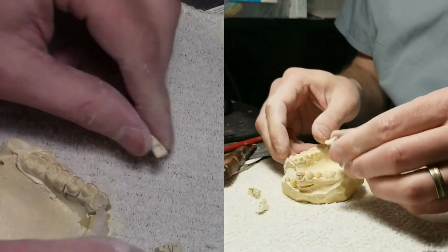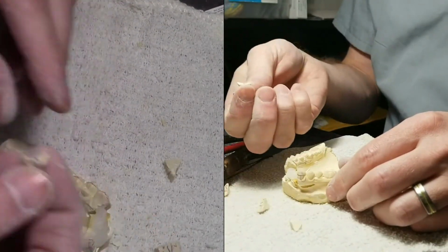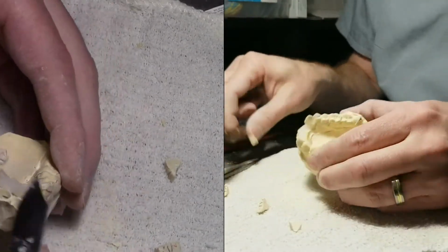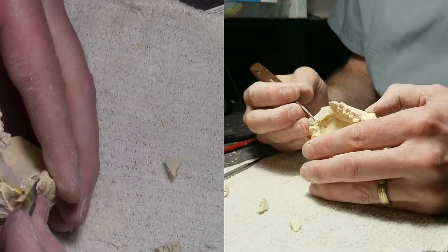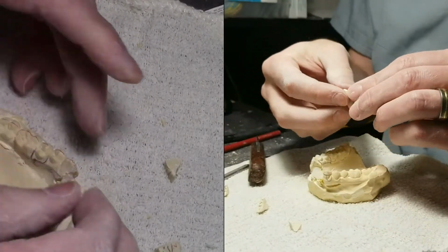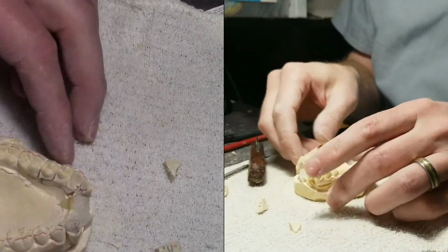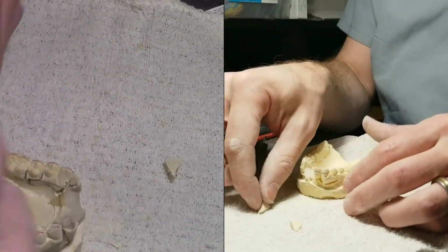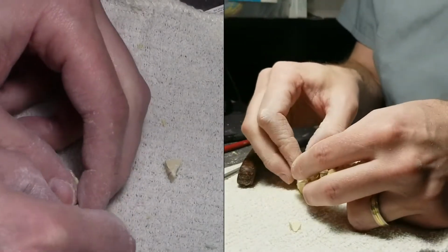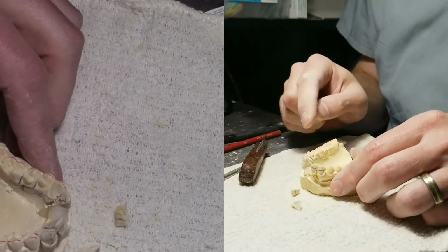So the next one is a 2, lower left 2. So I'm looking for it. There we go. Put that in there. Right there. Sometimes you gotta smooth off this on each side. Then I can either go to the other 2. You can see I'm starting to run into a problem. I got 2 teeth left, and there may not be enough room.